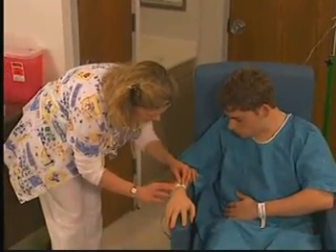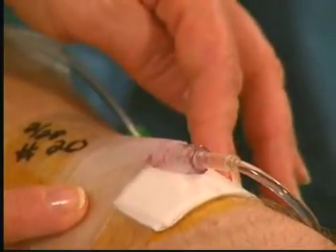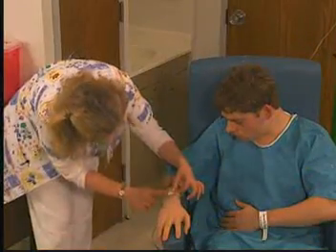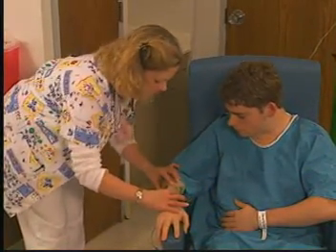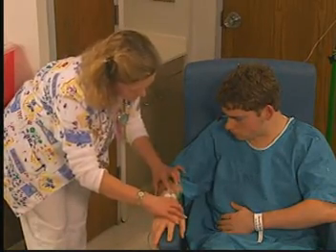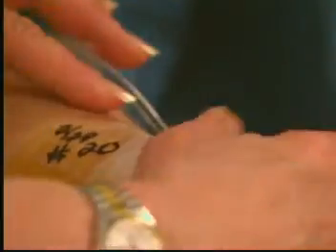Assess the infusion site. The tubing and catheter hub connection should be intact with no signs of leakage or bleeding. Bleeding may occur when the IV catheter and tubing become disconnected, the patient has a bleeding disorder, or the patient is receiving heparin. Next, inspect the dressing and IV site more closely.